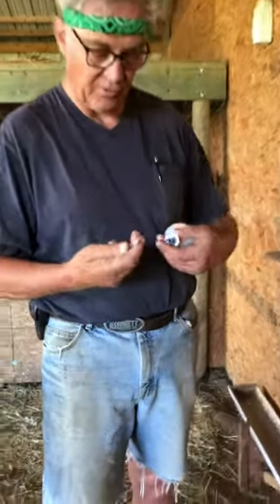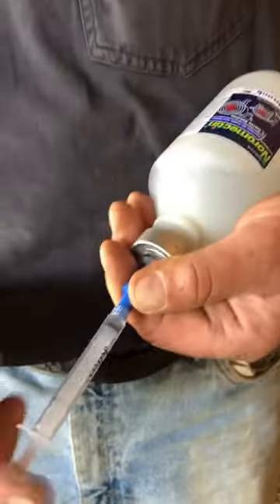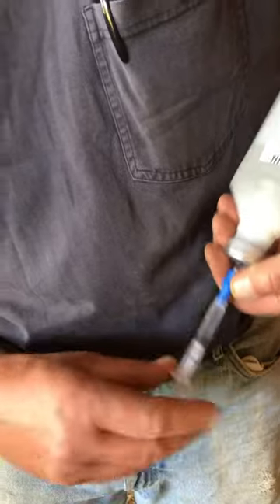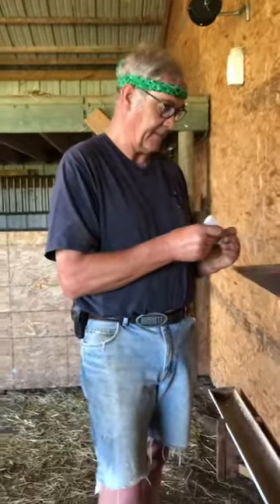For Lily, we're doing 2.1 mls. Attach that, push the air in, draw the air out of the syringe — 2.1 — then turn that off and get a needle.